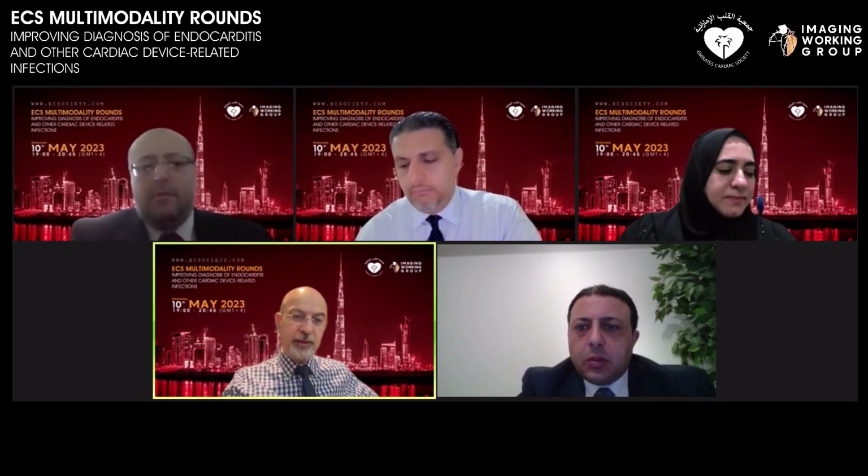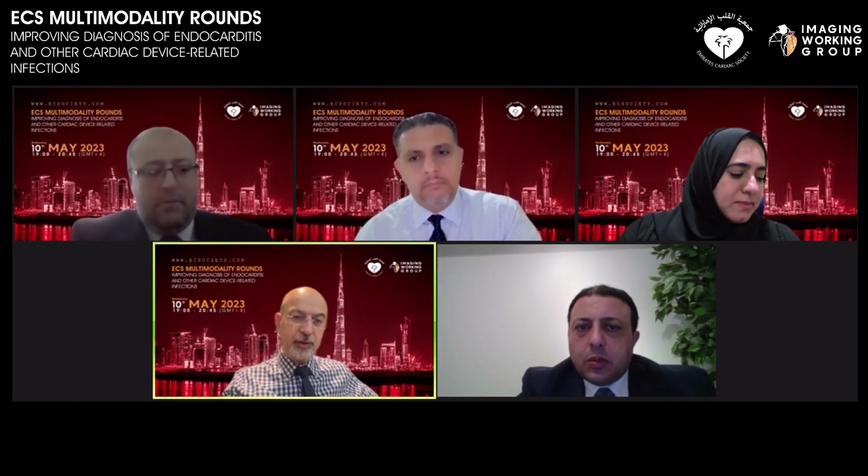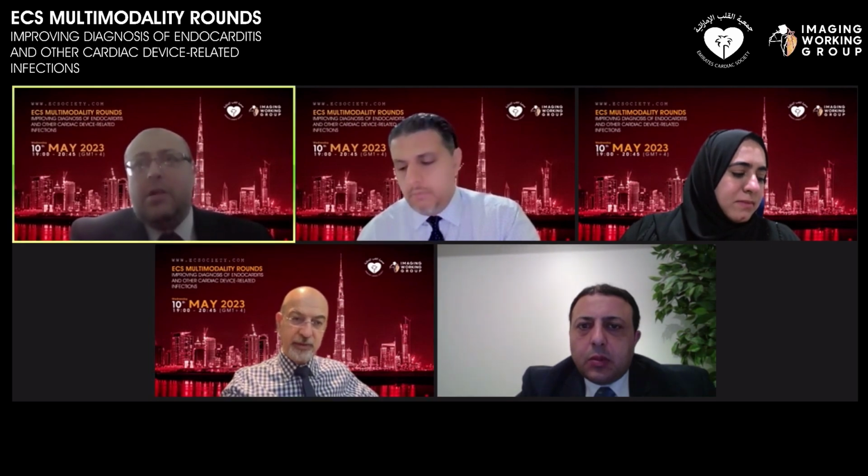Can I ask you a question about lead endocarditis? How often do you utilize FDG in your practice for patients who are suspected to have lead infection? When you see something moving on the TEE where you are not sure, and the patient has questionable bacteremia, how often do you reach for FDG? And what's your experience in terms of sensitivity?